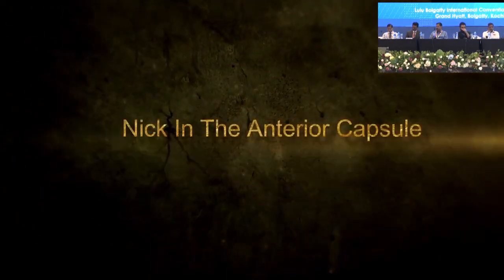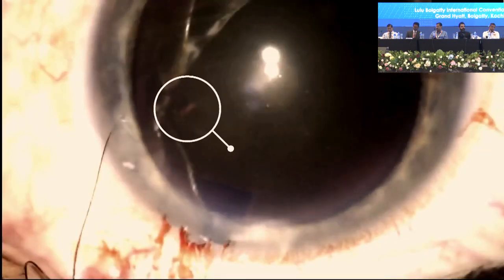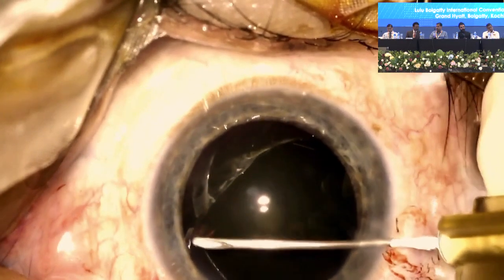In this next case, the surgeon has accidentally nicked the anterior capsule while making one of these incisions. This is what the tear in the anterior capsule looked like. The challenge in this case would be starting a tear and then trying to propagate it. So under an OVD cover, I introduce a cystotome from the opposite side and make a little nick.